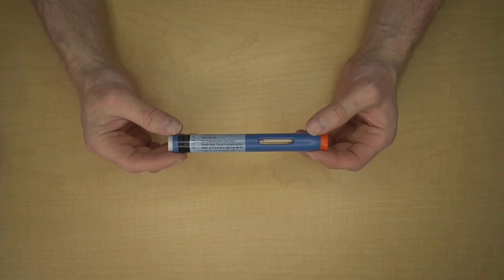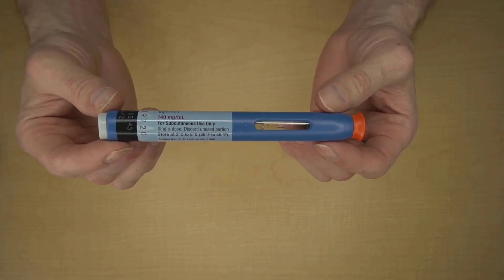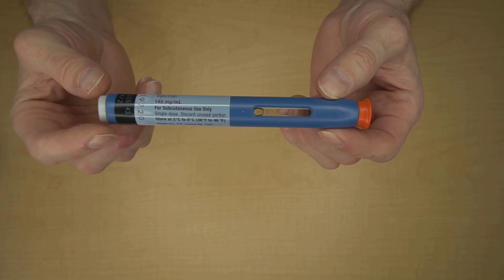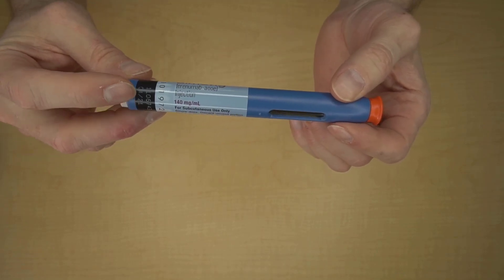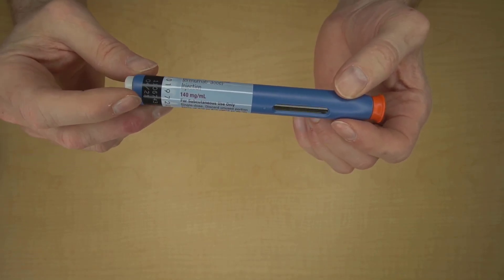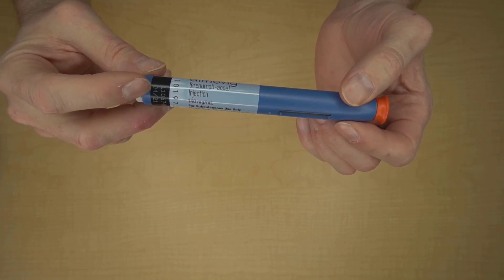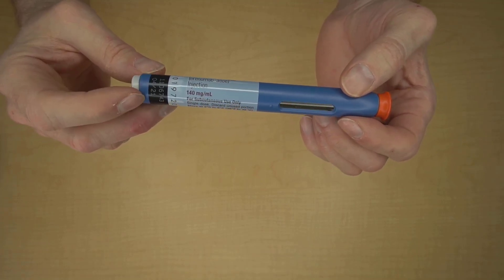Before we talk about the four injection steps, let's take a look at the auto-injector itself. Starting with the top right here, this is the start button. Right here, you can see the expiration date, and you should always check the expiration date and never use expired medicine. This expiration date is April 2021.